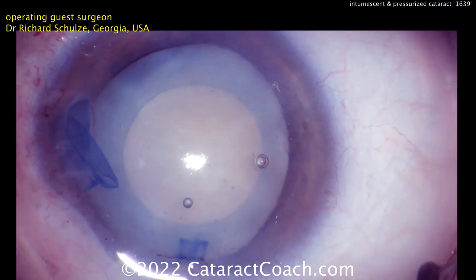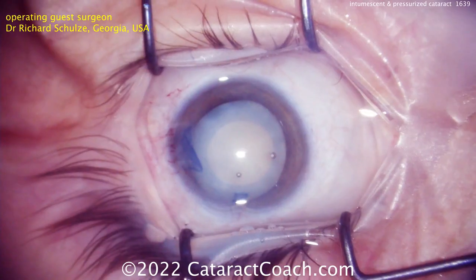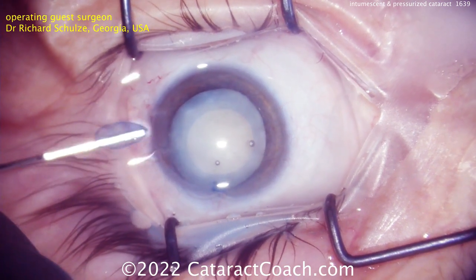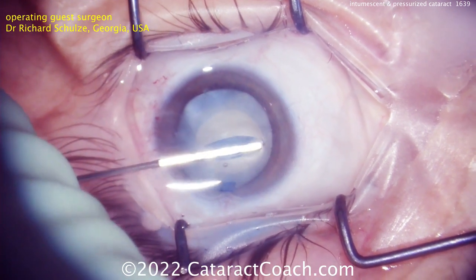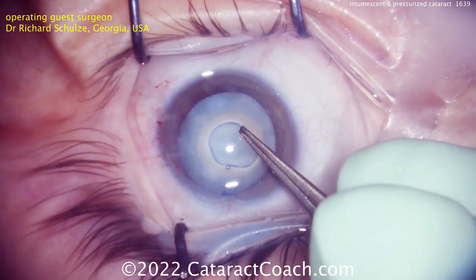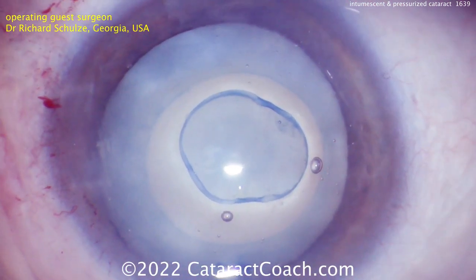The result is a perfectly centered capsulotomy. Look at the Purkinje image — the light reflex in the center of the cornea — and how beautifully centered that capsulotomy is. The central capsule remnant is removed and can be placed on top of the cornea for examination. Look at the edge — it's actually quite strong. The Zepto device, as it creates that instant precision pulse capsulotomy, strengthens the edge. The same applies inside the eye: the anterior capsule rim is stronger than you'd expect.